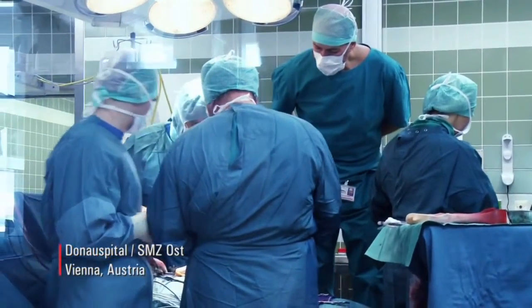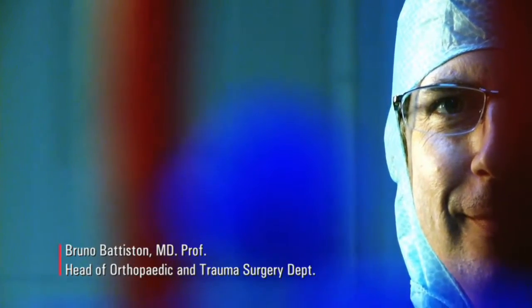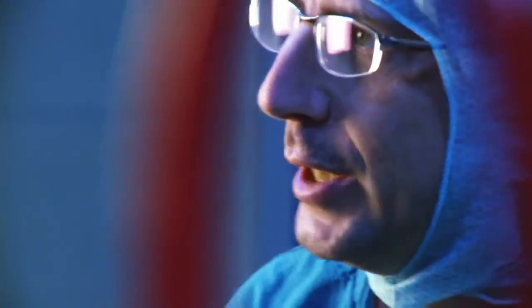For instance, in the field of urology, you use magnification in very different kinds of operations. One like vasovasostomy or varicocele, very superficial, very nice access. On the other hand, you need it for nerve-sparing radical prostatectomies, which is deep down in the narrow pelvis. So with head-mounted microscopy, you are flexible to do all of these procedures with the same microscope. The difference with the loupes is that I can move from dissection to really microsurgical procedures very easily, and so it gave me freedom of movement and really a possibility to change the magnification during the operation in respect to the normal loupes.